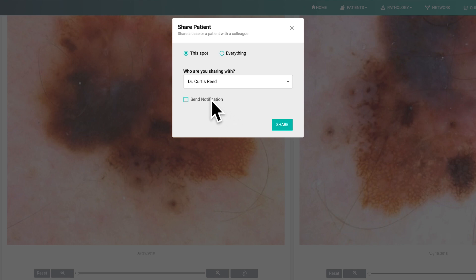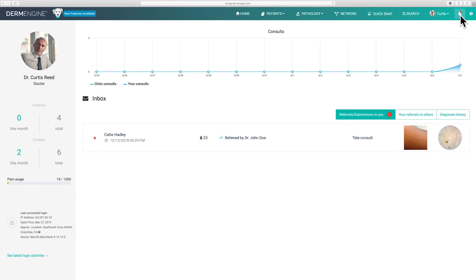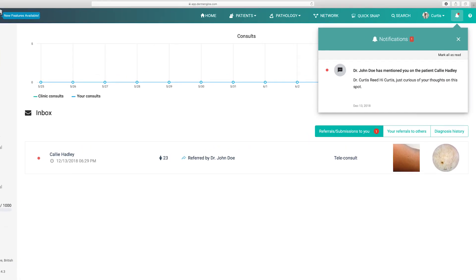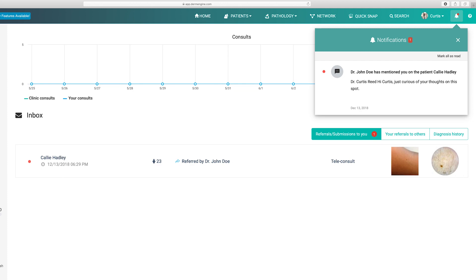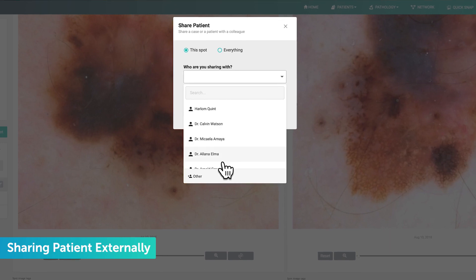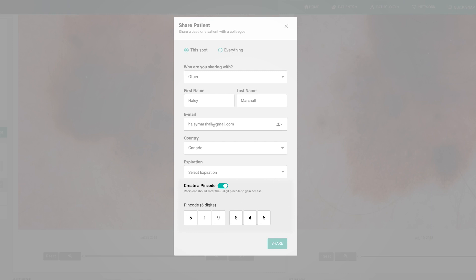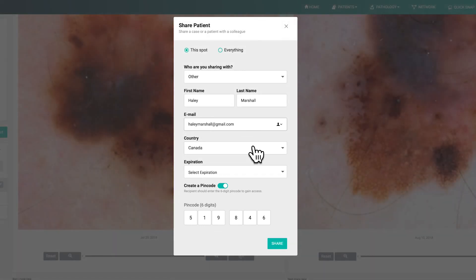To send a notification, make sure to check said notification. Once sent, your colleague will receive a notification by seeing a red dot next to the bell icon. Additionally, you can share a patient's profile outside of DermEngine by choosing Other when looking through your network list. Simply fill in your colleague's information and press Share. For security purposes, you are recommended to create an expiration and PIN code to ensure that the file is only accessed by the desired user. Just note, you do need to inform each recipient about their unique code.